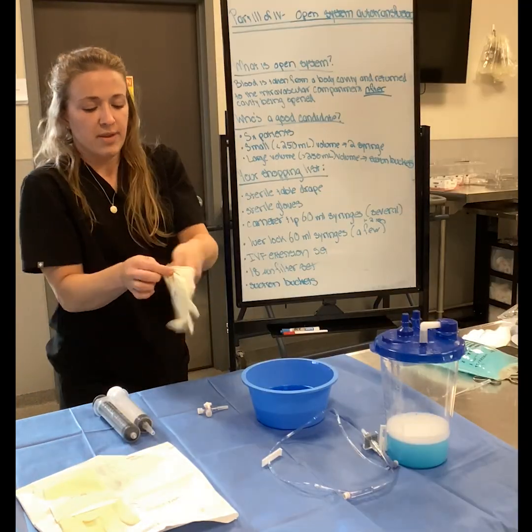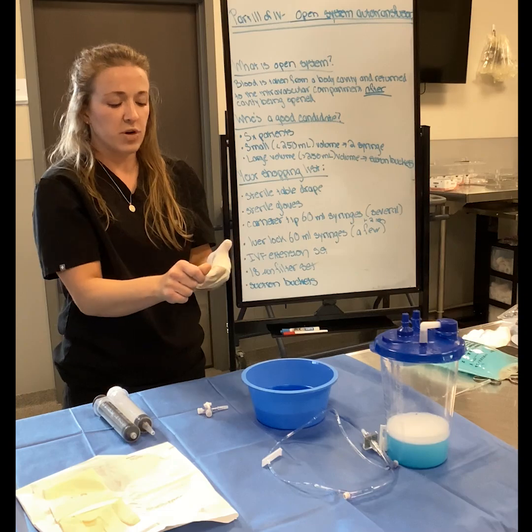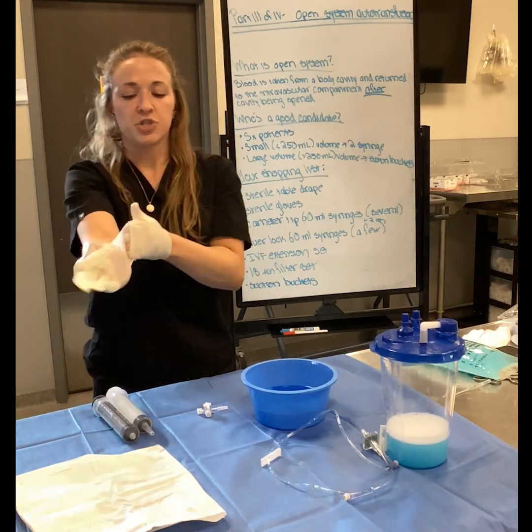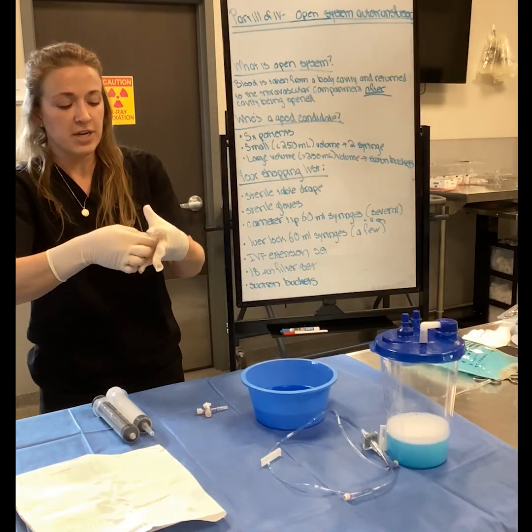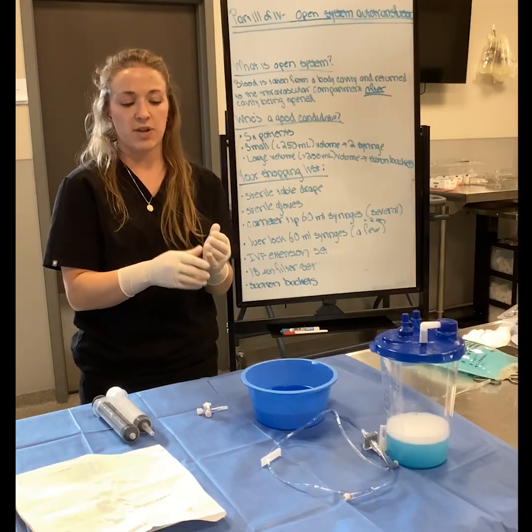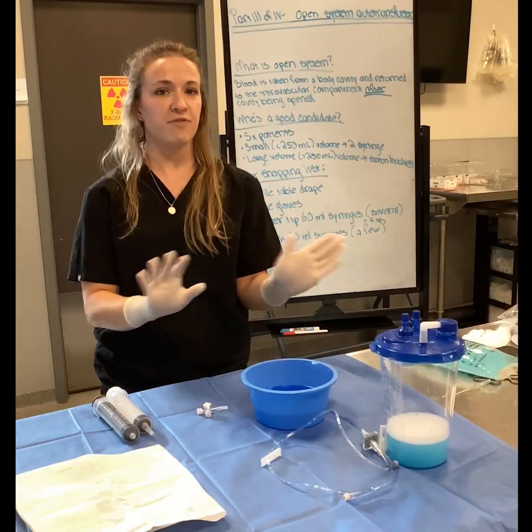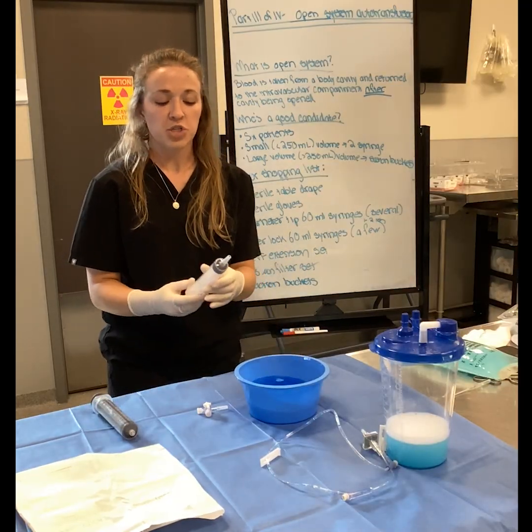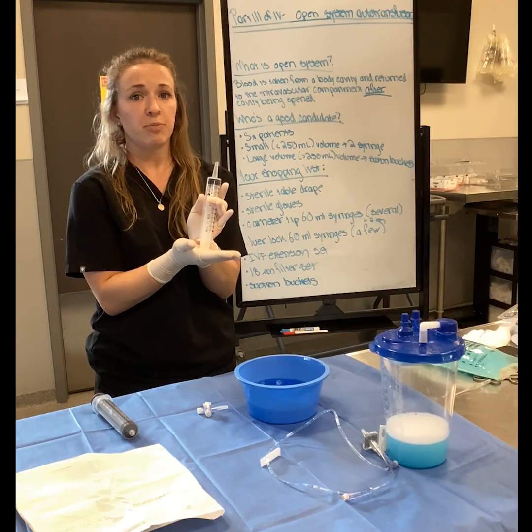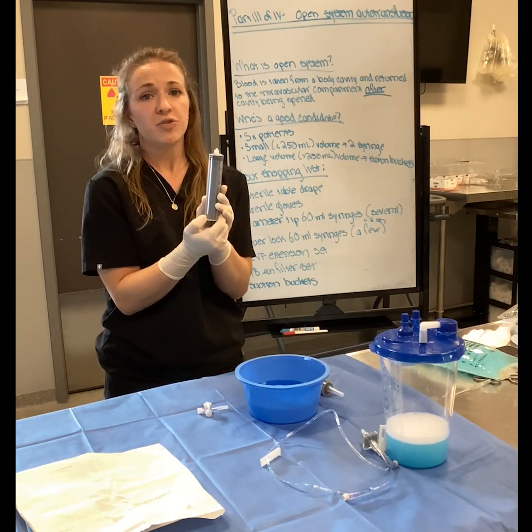So I'll have this. Now, with the 2-syringe technique, you're usually going to be working with at least one other person. So that might be your surgeon or your doctor who is operating on the patient. And then you are the technician, doctor, whoever, who is providing maybe anesthetic care to that patient. So I'm going to be both of those people today, but I just want to show you how the physics of this works. So what I do is that I'll usually open 5 or 6 on the table, on the surgeon's operating table for them. So that way they can just keep doing that and handing that to me. I'll open up 1 or 2 of these for myself.